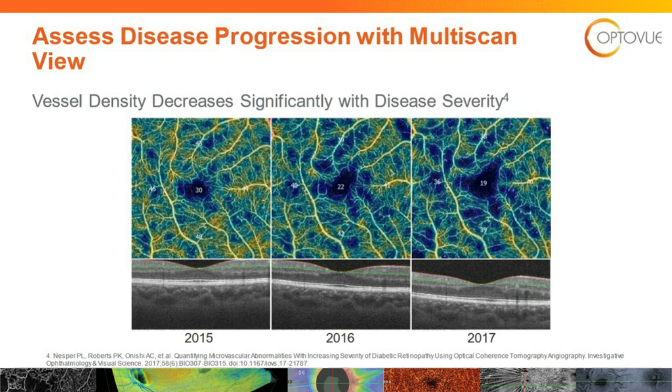But if you go up to the vessel density, you don't even have to worry about looking at the numbers, you'll see the percentages dropping. But you can see that as you go from 15 to 16, the blue lakes, which is showing dropout, and how expansive it had to be to even start showing some changes in the B scan. Again, another asset for following the diabetic patient in the practice.